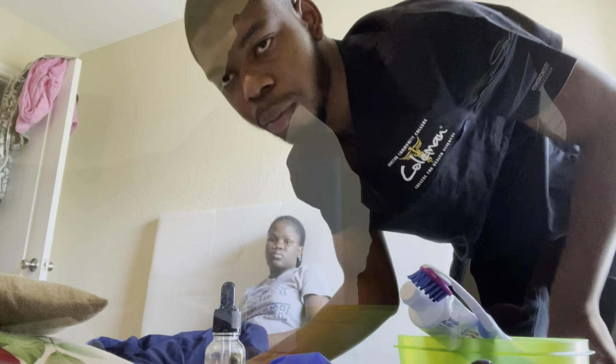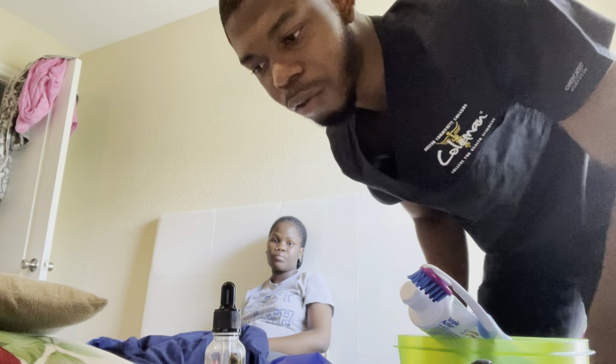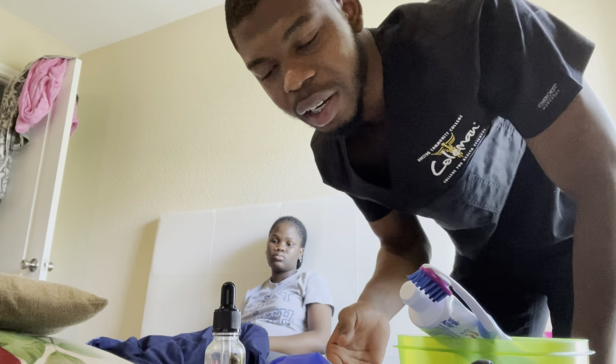Thank you. Hello Professor, I'm Naso Muhammad, and today I'll be making a video on how to perform a nasopharyngeal suction. Before I start this procedure, I would first of all like to confirm my physician's order to perform a nasopharyngeal suction on this patient, and after that, I will list out the equipment needed for this procedure.